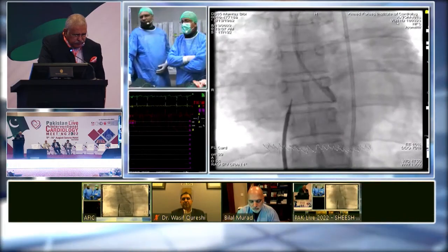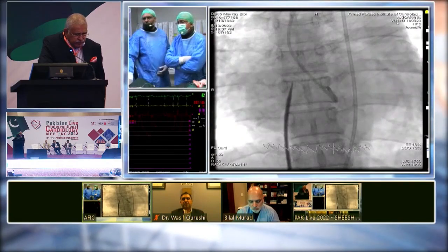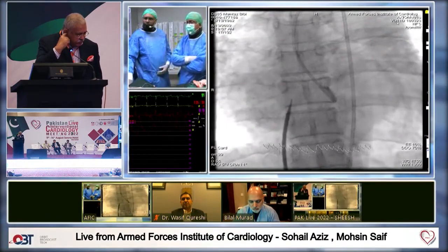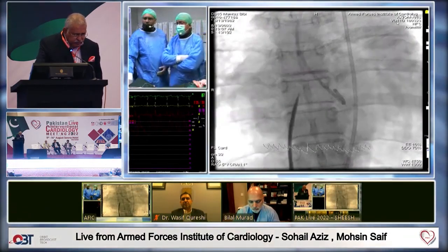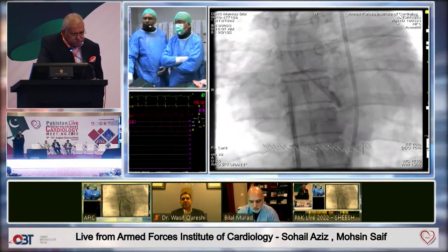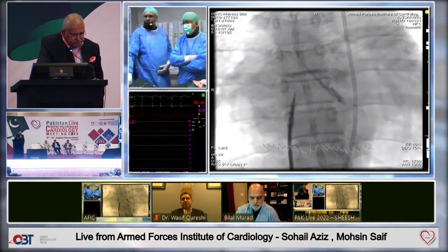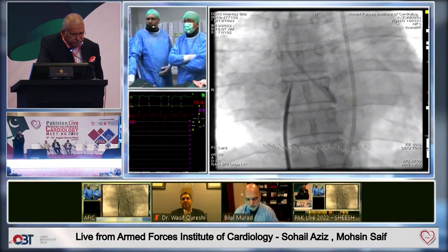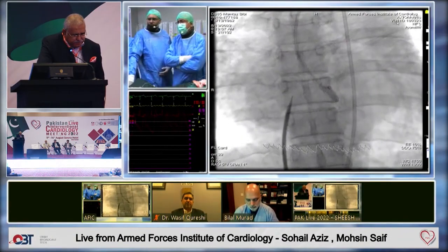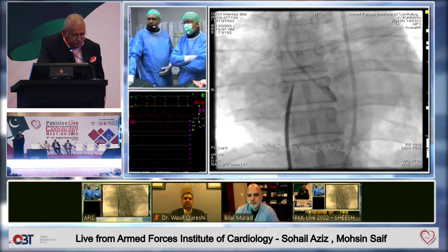So next, what I did was I stuck the needle in there, and this is the puncture. If the puncture and the balloon do not stabilize, I stick the needle up just a millimeter or so so that it catches on something. If I'm happy, then I come back. In this way, at that puncture, I do this injection, and you can see the superior wall of the LA. That's where you visualize. I hope you can see that on the screen.